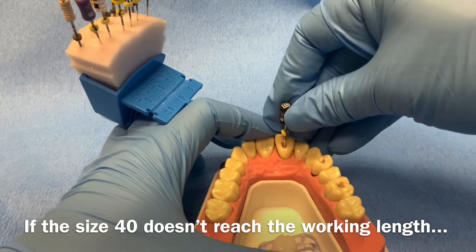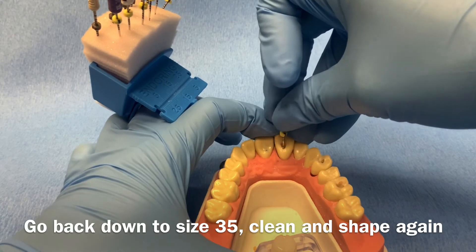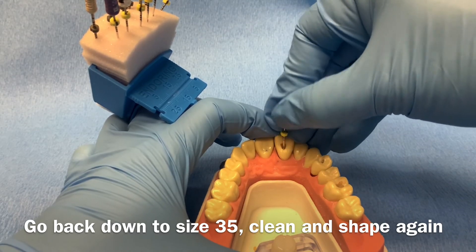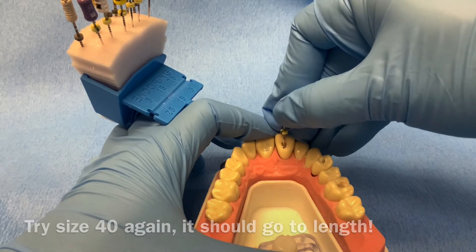If your size 40 file does not reach working length while cleaning and shaping, go back down to a size 35 file. Clean and shape with this file until it feels looser within the canal. Irrigate and recapitulate. Try the size 40 again — it should go to working length.